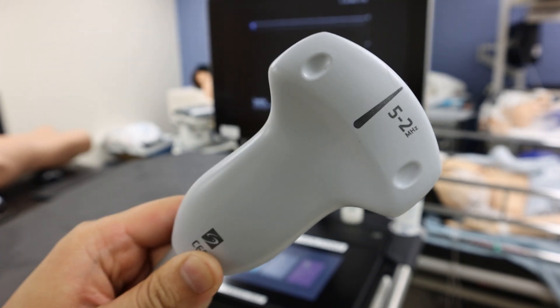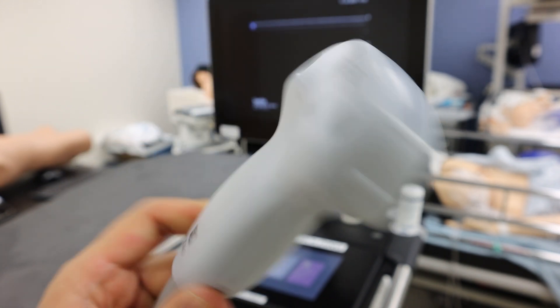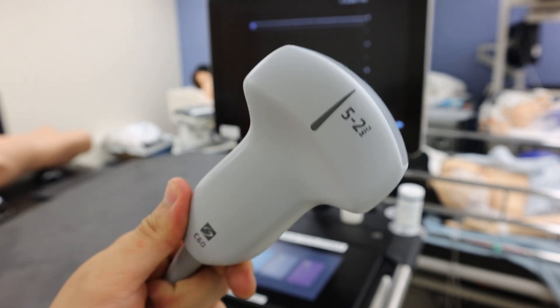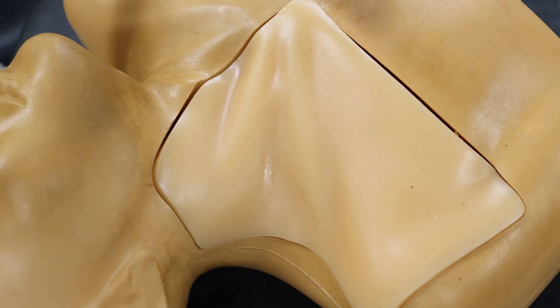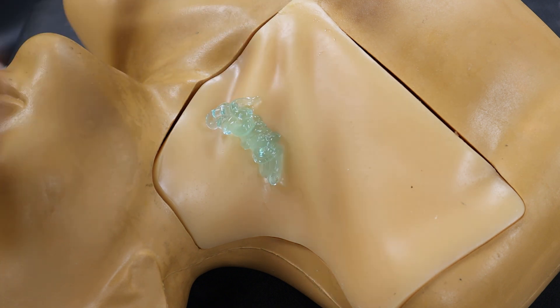Bigger curvilinear probes are designed to look deeper and wider and will not give you the same image quality. So be sure to select the right probe. A lot of woes using ultrasound can honestly be solved by just using more ultrasound gel, so get a really nice dollop on there and replenish it throughout your procedure if needed.